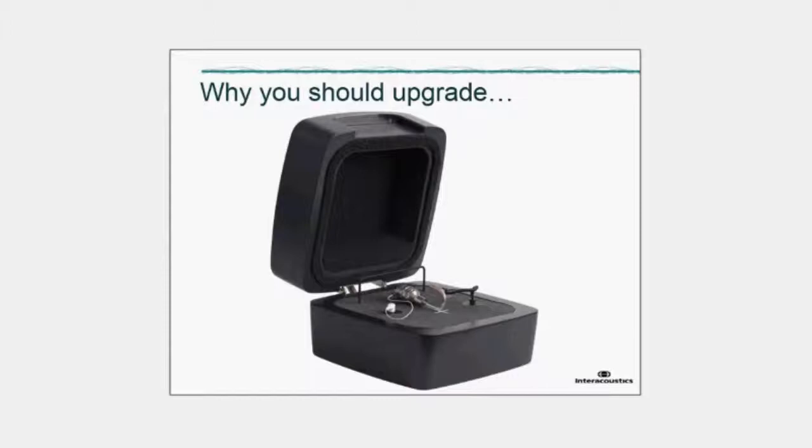I must inform you all ahead of going further within this presentation that this is a lighter release, meaning that the main feature is this, and we've taken some smaller improvements and improved that within the software as well. Therefore, the duration of this may not fill the time that was allocated in the first information within the invitation. So the biggest thing that we have is the TBS10. And then, as mentioned, we've taken a handful of items and we'll be presenting a few of them today as to improvements within the software.